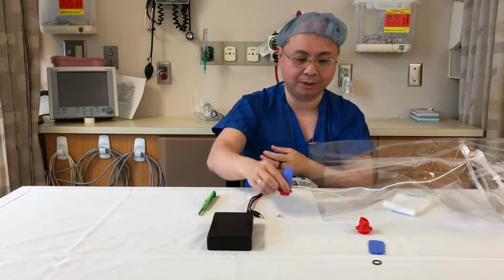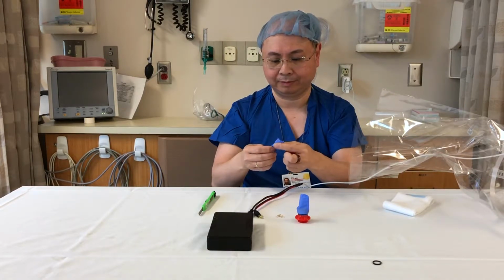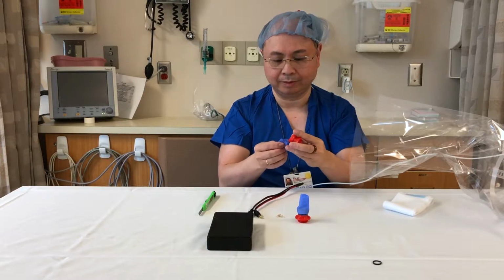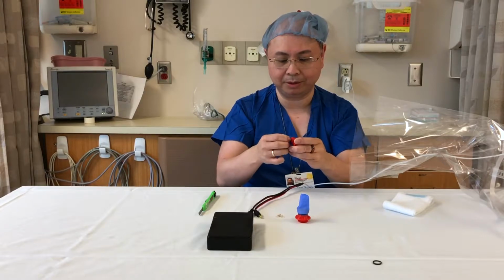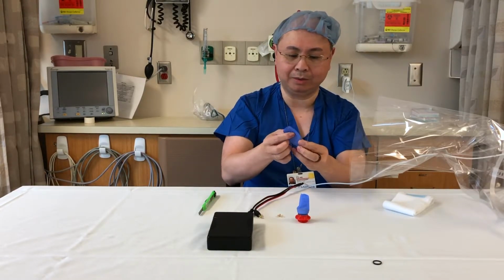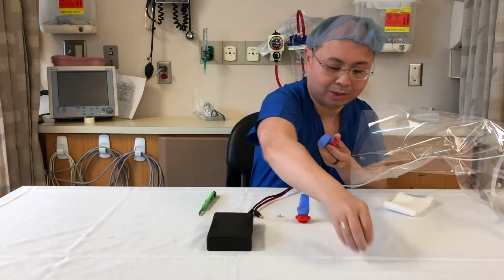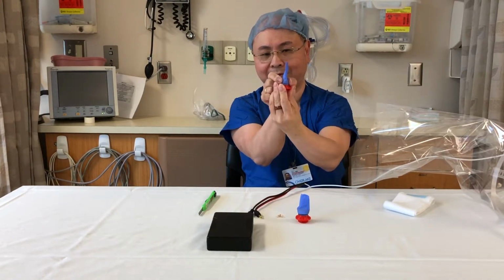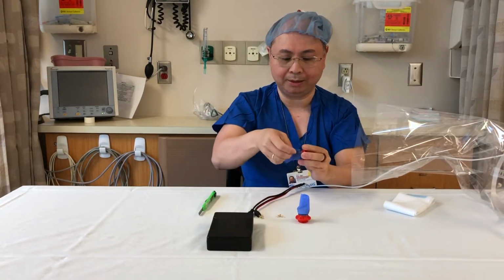There, one valve is done. Let's do the other one. It's best to use the longest fingers from your exam glove, because the better valves are created with a longer segment. Once more, we're aligned with the axis, with the flat plane of the glove, secure with the rubber band.